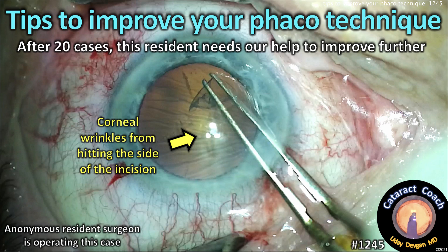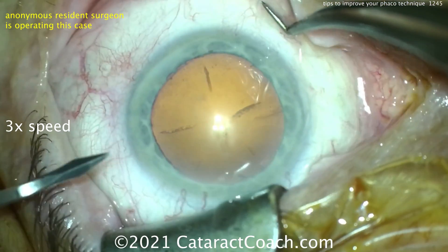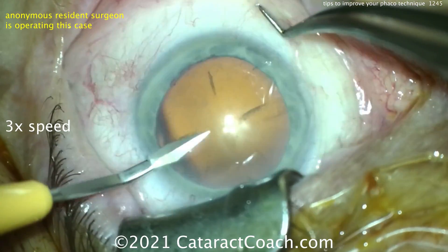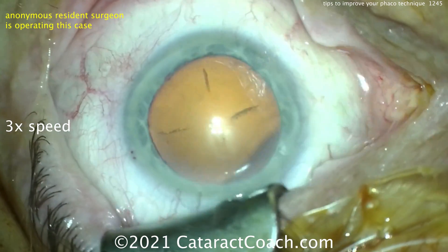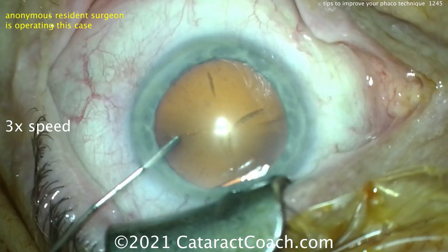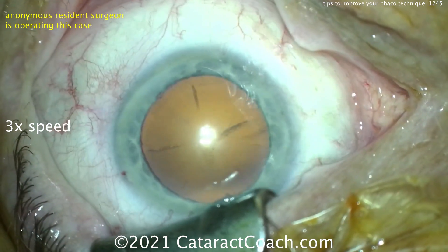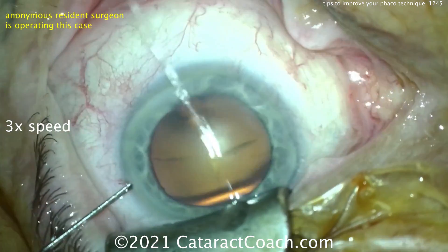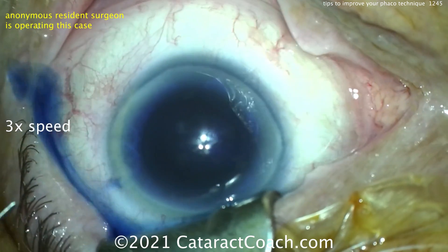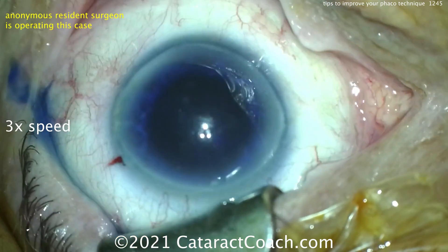Cataractcoach.com — tips to improve your phaco technique after just 20 cases. This resident needs our help to improve further, so we're going to show the whole video three times at normal speed. I have no idea who this is — a totally anonymous resident sitting superiorly. I'd first start off by saying that you want to get that lid speculum more out of the way; it's right in the way of where you want to make that superior incision. Try trypan blue dye going in — you don't really need it in this case; I'm not sure why you're using it.